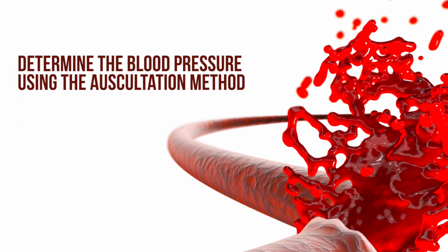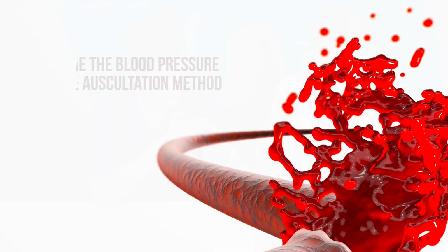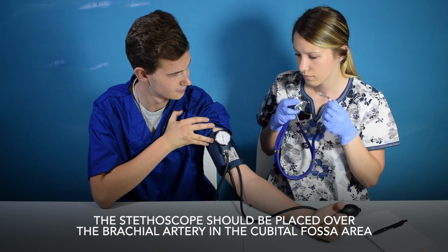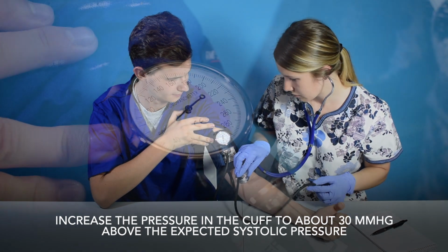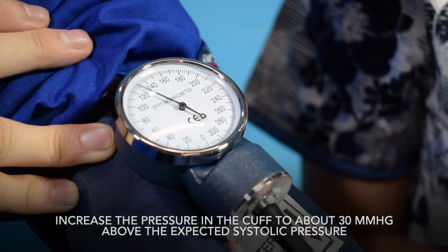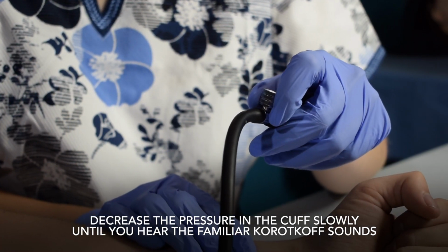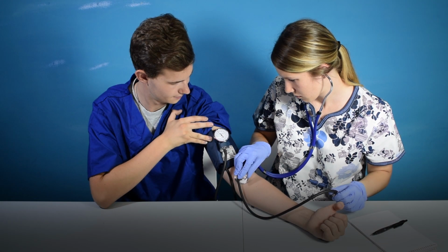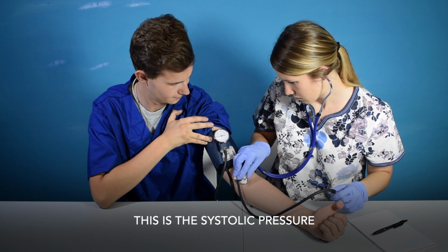If you have a stethoscope at your disposal, you can determine the blood pressure using the auscultation method. The stethoscope should be placed over the brachial artery in the cubital fossa area. Increase the pressure in the cuff to about 30 millimeters mercury above the expected systolic pressure. Decrease the pressure in the cuff slowly until you hear the familiar Korotkoff sounds. This is the systolic pressure.